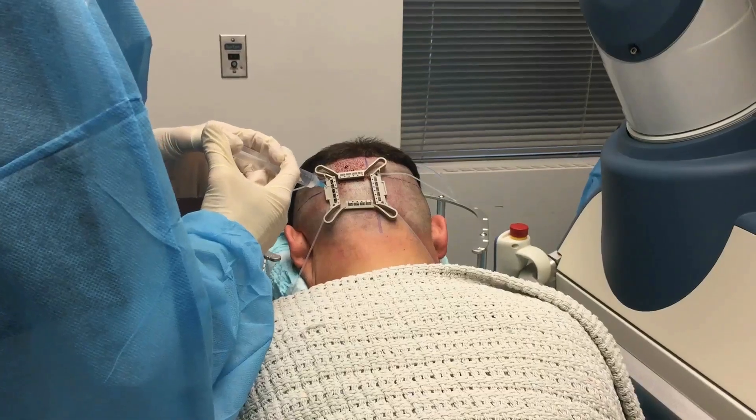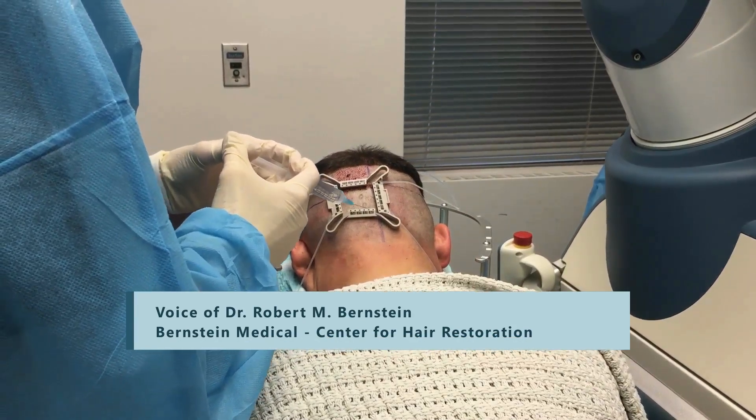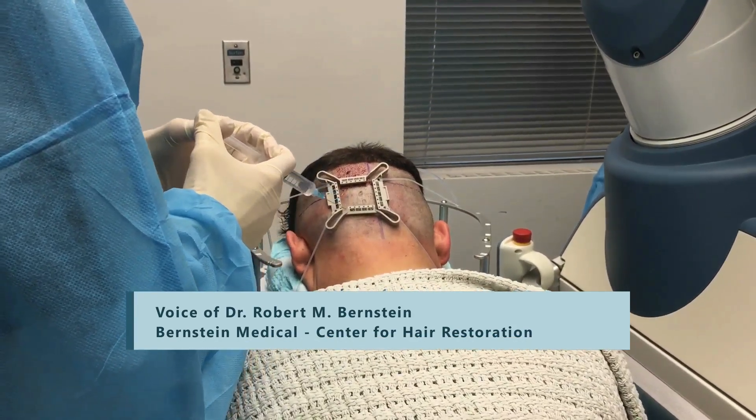Here I'm adding tumescent anesthesia. It's a combination of xylocaine, marcaine, and epi — very dilute.